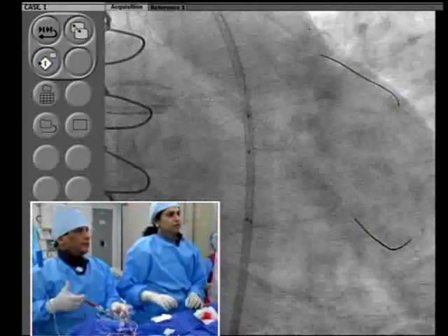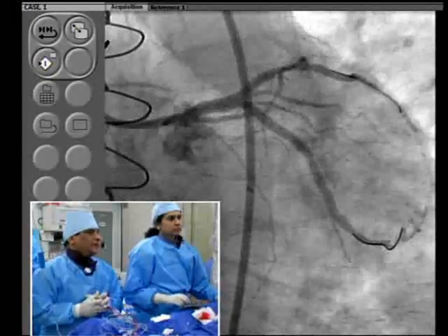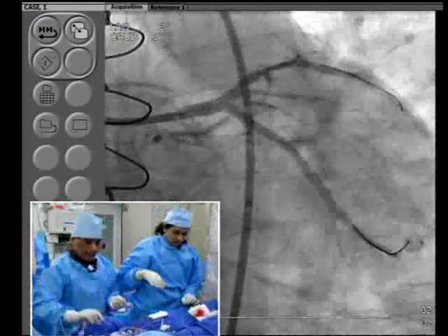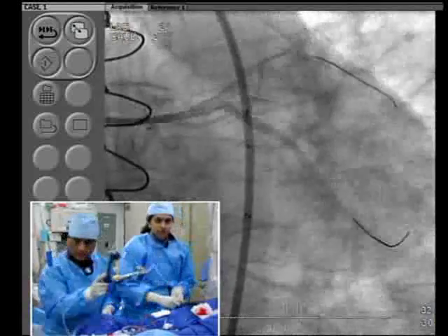Same thing, okay. Take a picture. Yeah, take a little picture before, so that in case you need to advance something individually. Looking very good there. Same, yeah, we have two balloons, the descending portion of the guide, and took a picture, and now we are coming out.